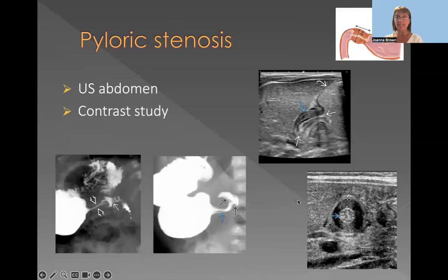No. This is different. So what's happening here? On the ultrasound, always when you do the ultrasound of the bowel, I don't have the slides here, but when you do the ultrasound of the bowel, you can see very clearly 5 different levels of the bowel wall, because you have mucosa, submucosa, muscularis propria, 5 different levels.